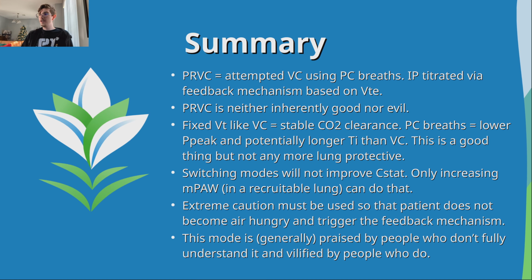As I was talking about earlier, only increasing mean airway pressure in a recruitable lung can do that. That is the only way you will actually improve static compliance, if the patient's lungs actually get better and you recruit more. And you can do that in any mode, essentially. Some modes are better for it than others, but you can do that in any mode. Extreme caution must be used so that the patient does not become dyspneic and air hungry and trigger the feedback mechanism. And this mode is generally praised by people who don't fully understand it and vilified by people who do.